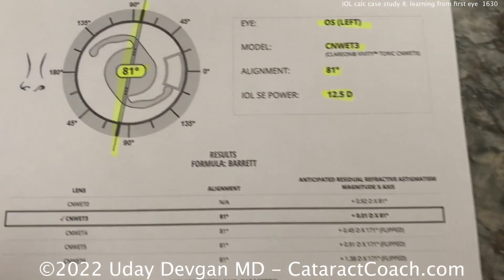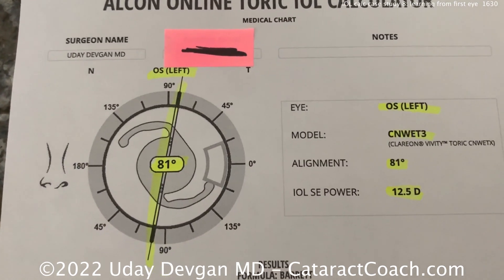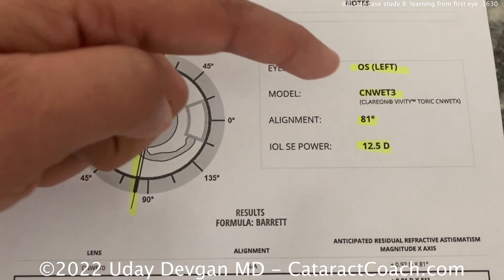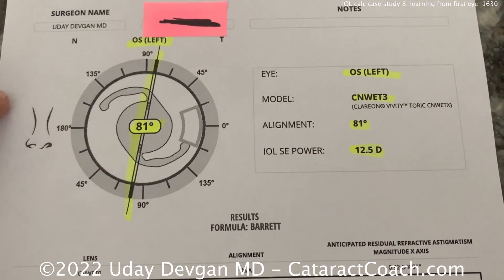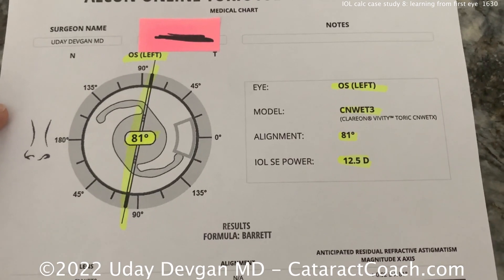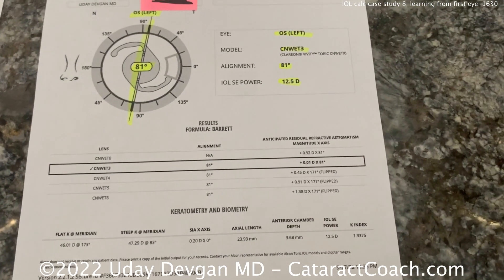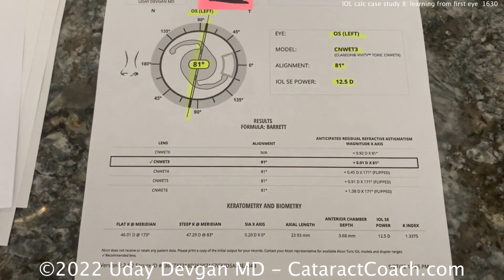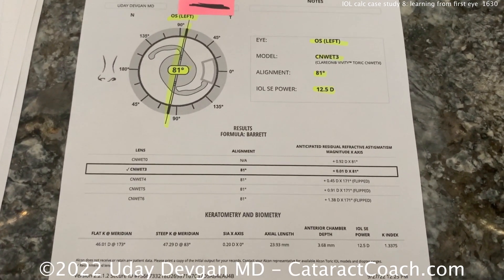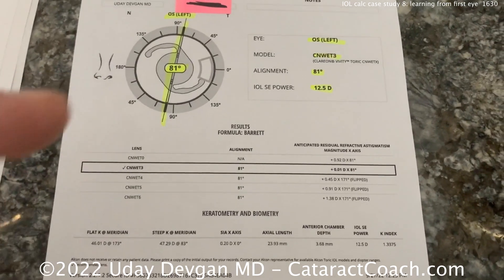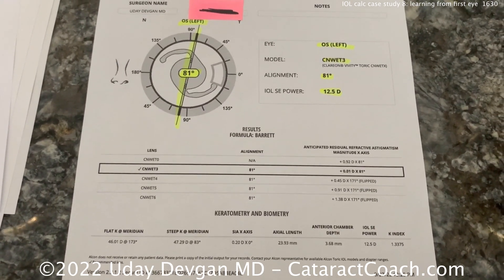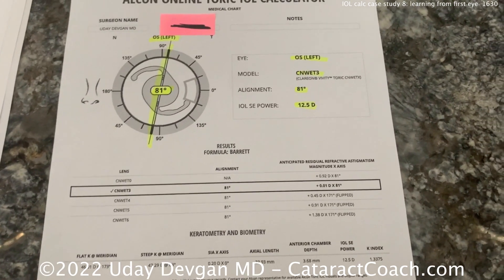So there's what we planned out: the left eye is going to get that toric version of the extended depth of focus lens at 12.5. Now you may ask about intraoperative aberrometry — also a good option, but that's really not the issue here. Remember, there's a lot of change that happens afterwards. This patient on post-op day one was pretty close to plano, but ended up shifting as he healed up.